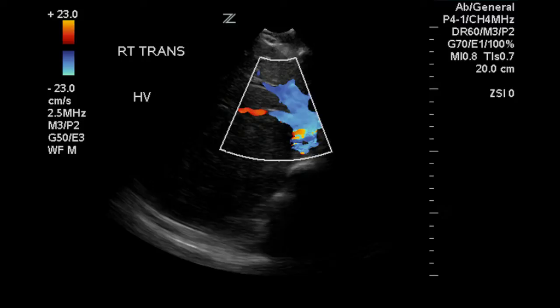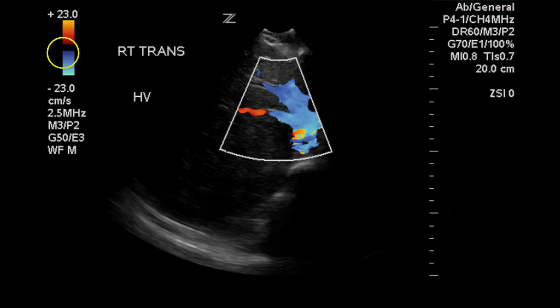This is an abdominal Doppler exam to rule out Budd-Chiari syndrome. This first image demonstrates good flow in the hepatic veins. The flow is downward, indicated by the blue color.